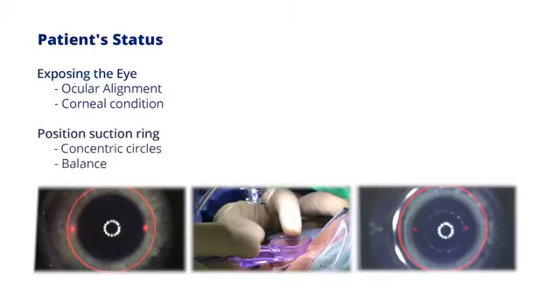Position the suction ring to keep the red circle suction ring, cornea pupil and light reflex on cornea in a concentric circles pattern. If the palpebral fissure is still very small or the eyelashes interfere the path, you can pull the upper lid a little bit upward and tilt to one side of the suction ring to get into the upper sclera space and then the lower one.